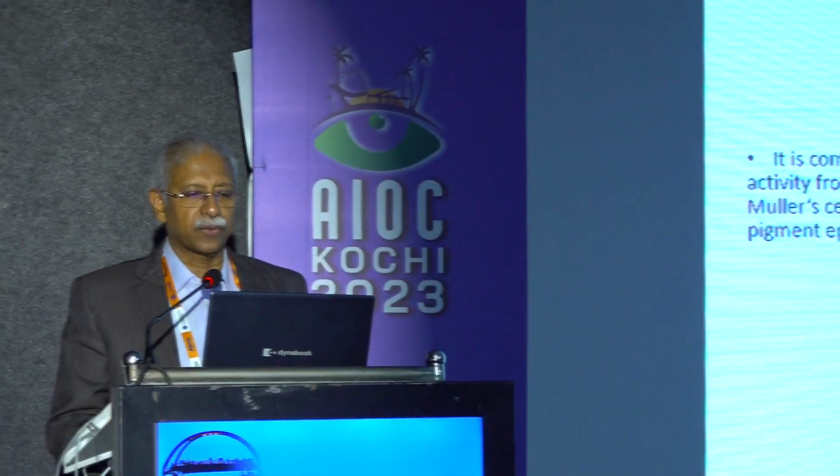So ERG is quite important. It can be used in regular practice. We're not limiting ourselves to only retinal practice or neuro-ophthalmology or a practice involved with genetic disorders, where ERG is used far more commonly. But even in day-to-day practice, it's very, very useful.